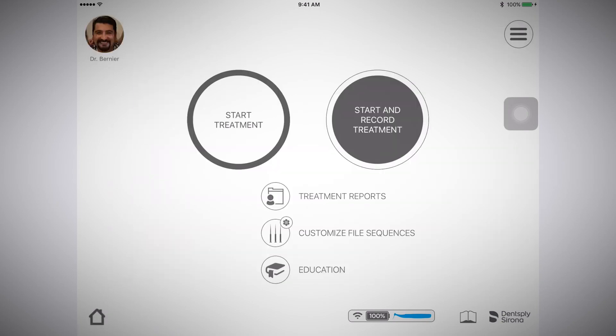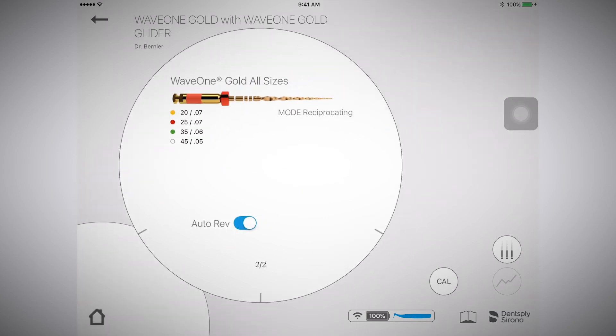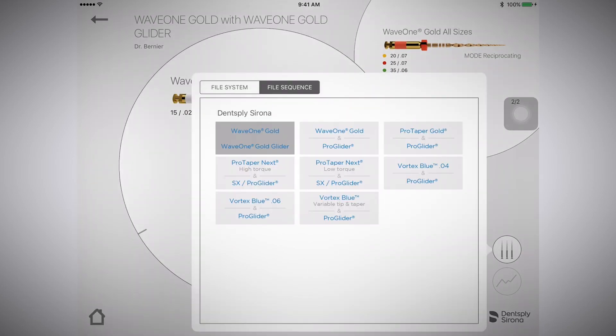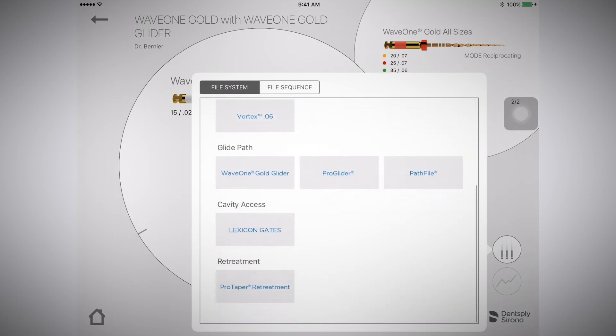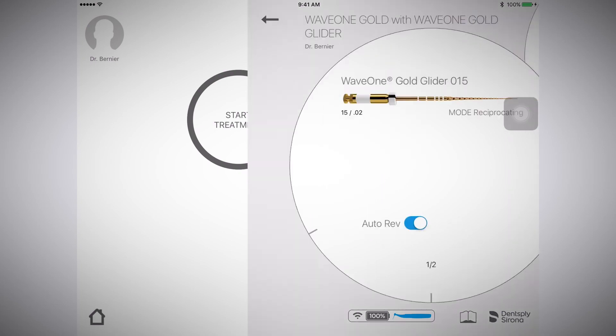Next, you will find start and record treatment and start treatment. Both are where you will start your procedure. However, with start and record treatment, your procedural information is being recorded. Good luck.